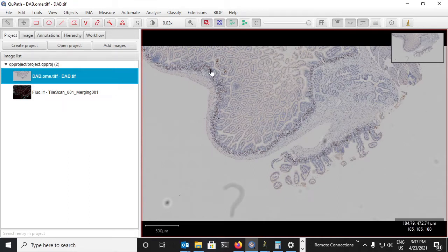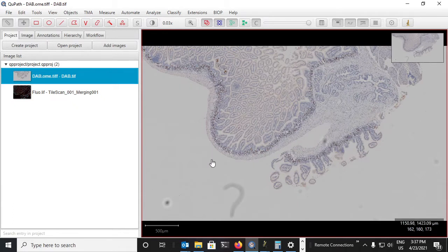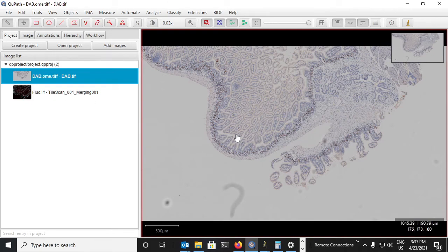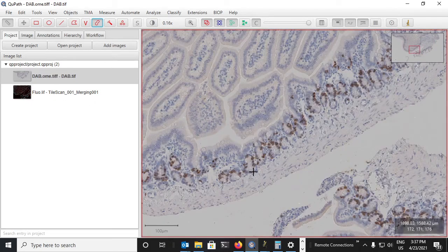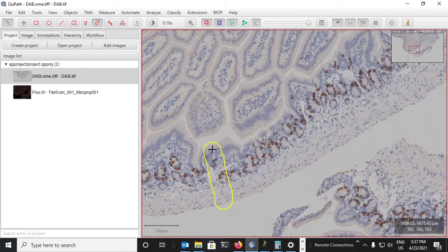This has been saved automatically inside our QuPath project and now we can use that to transfer annotations from one image to the other. So let's go ahead and create some annotations and detections on this image.